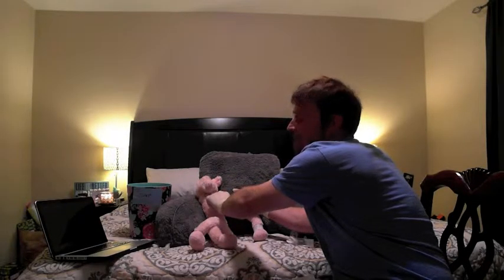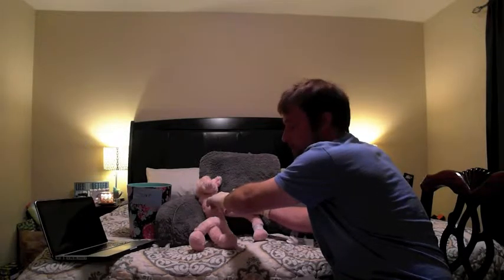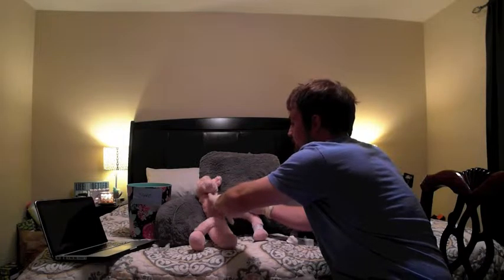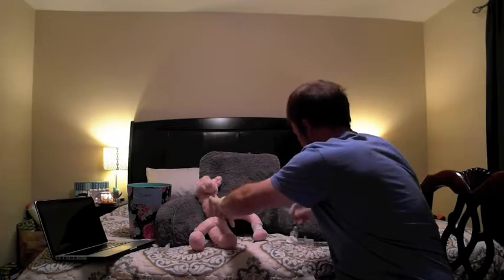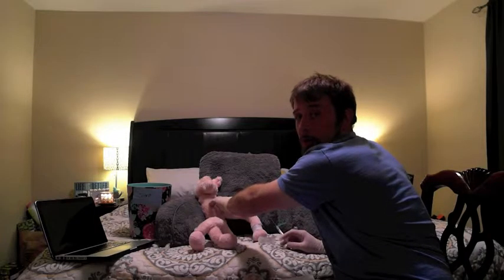Pull back to aspirate to see if I've hit a vessel. If there's any blood, I have to start all over. Since I have not, that's a good sign. I'm going to inject the patient, pull the needle out, and I'm going to hold the cotton ball there to let the bleeding stop.